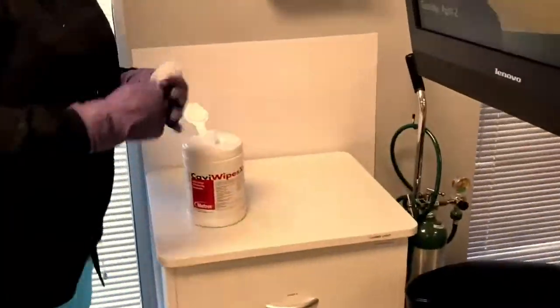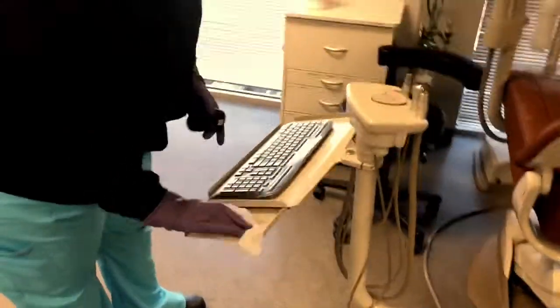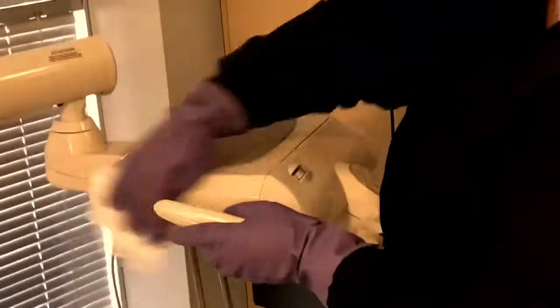After letting the Cavicide sit, Samantha's going to go ahead and start wiping everything down with Cavicide wipes. As you can see, she's getting every part of the operatory. Just like I explained earlier in the video, you never know what could get infected. Always make sure you're treating your patients with decency and have that amount of respect to clean everything down. As you can see, she's going through everything. A great example of how to clean the operatory room. Good job, Samantha.